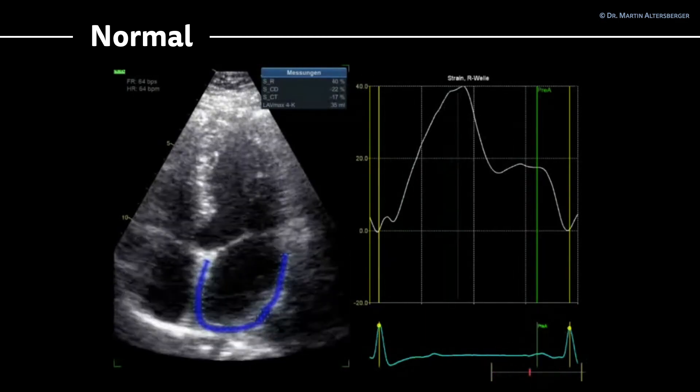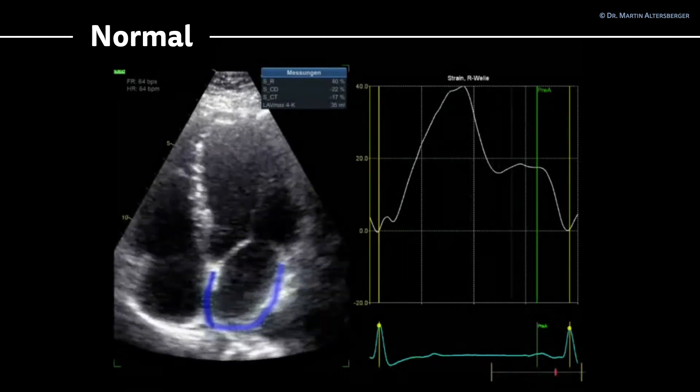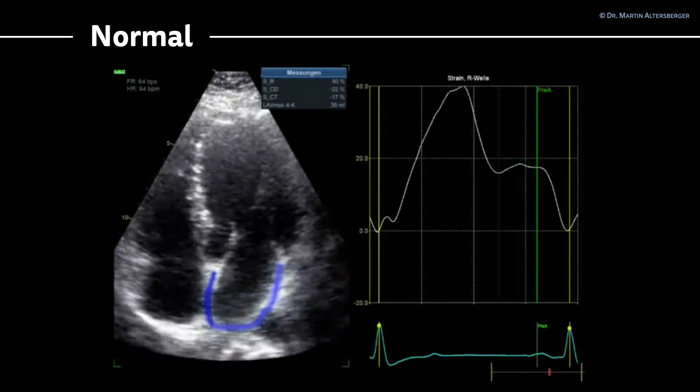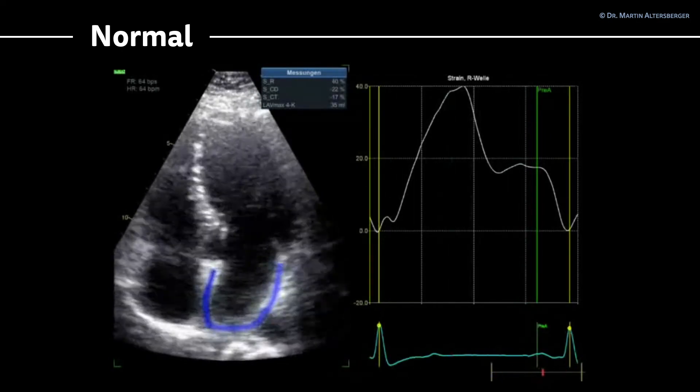Let's move on to a brief summary about all the measurements we can have in diastolic dysfunction.